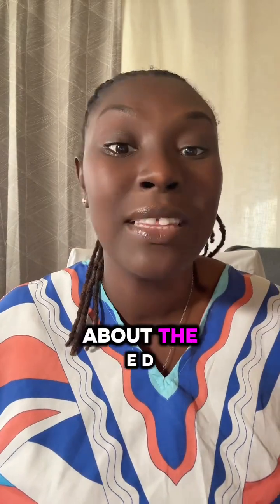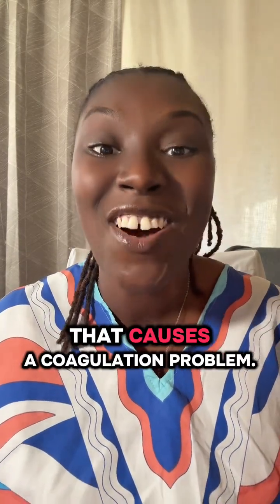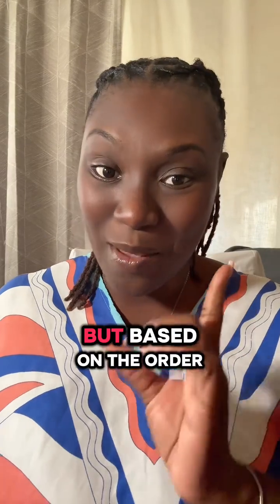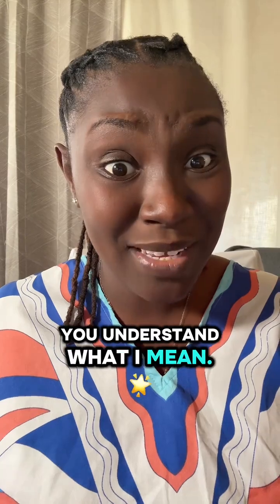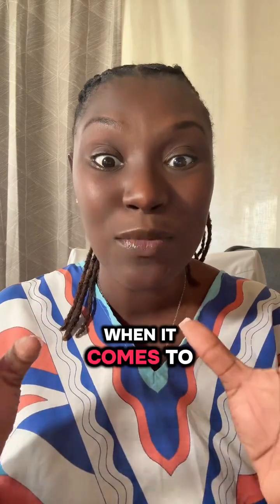So if we talk about the EDTA lavender tube and we collect a light blue, again, that causes a coagulation problem. But based on the order of draw, sodium citrate can go into EDTA without any problems. So you understand what I mean? Certain additives cannot be mixed with other additives. That is the main thing that I want you to remember when it comes to the order of draw.